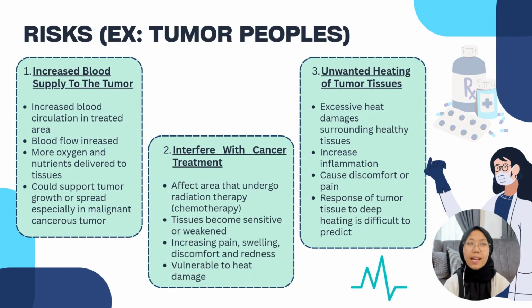Although medical diathermy has many benefits, it is generally not recommended for patients with tumors, especially malignant or cancerous tumors. It is because, firstly, diathermy can increase the blood supply to the tumor. Since the treatment will improve blood circulation, more oxygen and nutrients are delivered to the affected area. This may potentially support the growth or spread of the cancer cells.